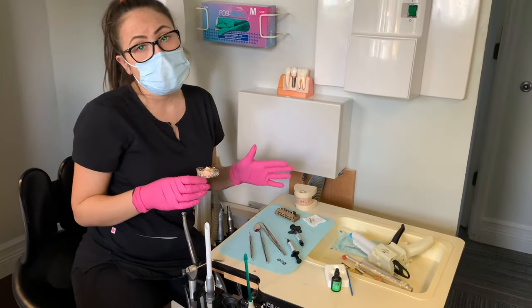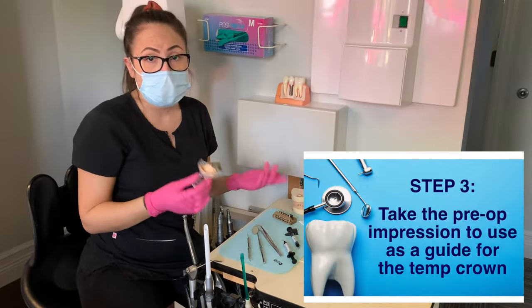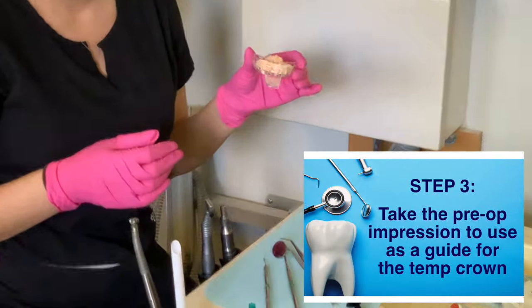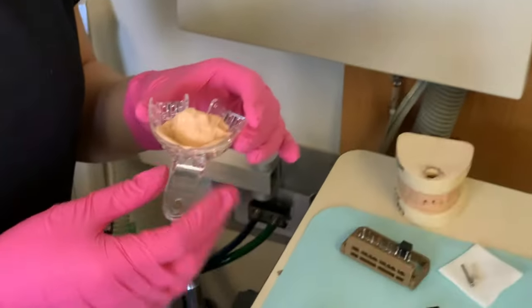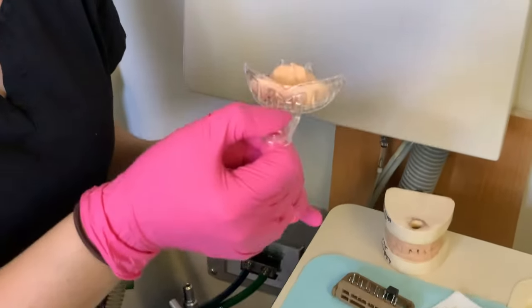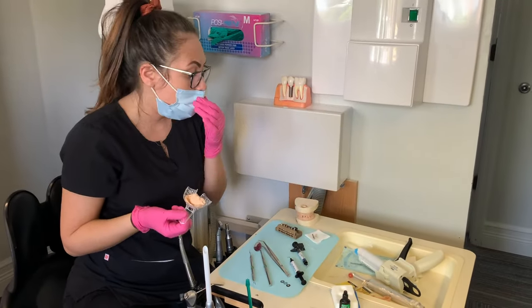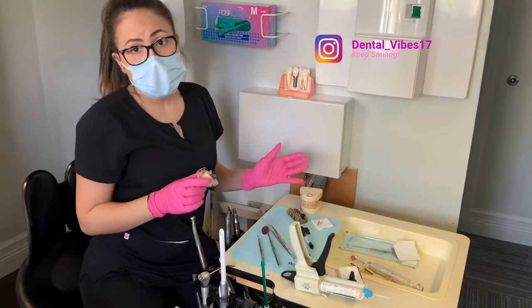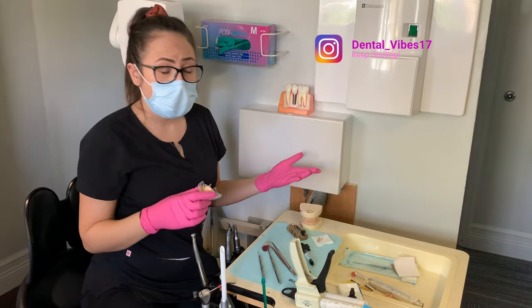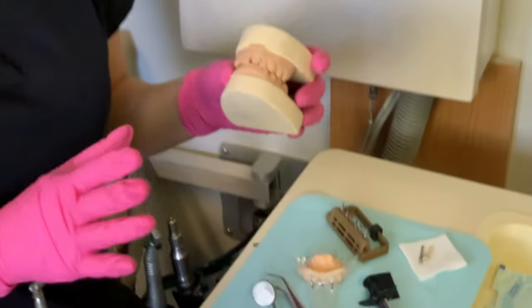After you make sure that your patient's tooth looks good, you're going to go ahead and take the impression. I use an anterior quadrant tray here. I use some Algenet, put it inside the tray, put it inside the patient's mouth, take the impression. After that, you're ready to make your temporary. Of course, we don't have a patient here, so we are using the model that we got from the lab.